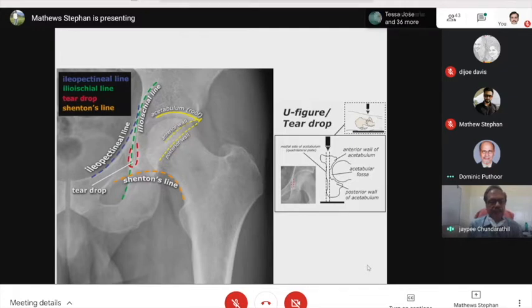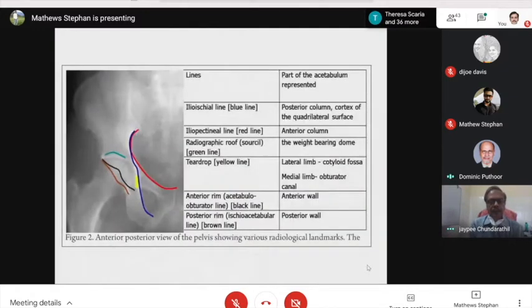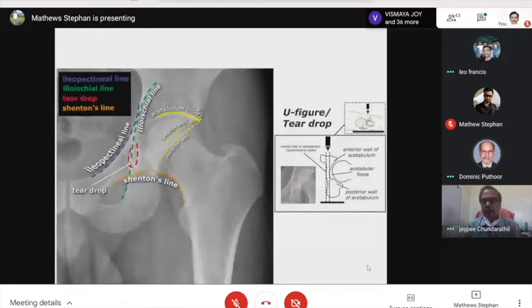She might know where it has been kept. There is a template in that file. That template can be kept over a pelvic section.